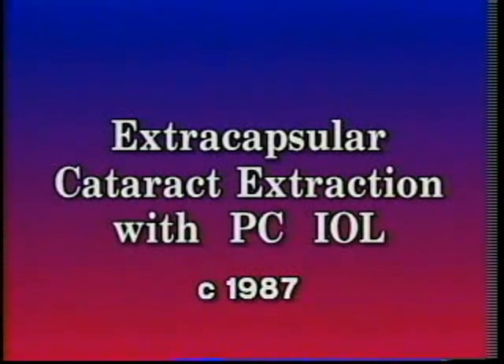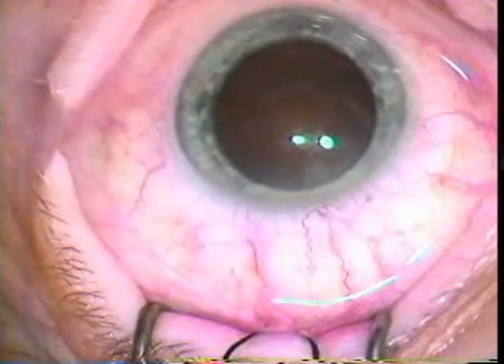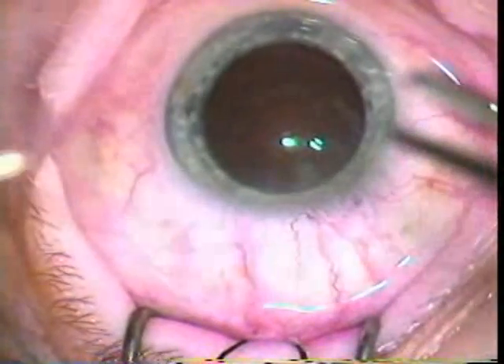Here's an example of an extracapsular cataract extraction that was done by Dr. Kolder in the late 80s.